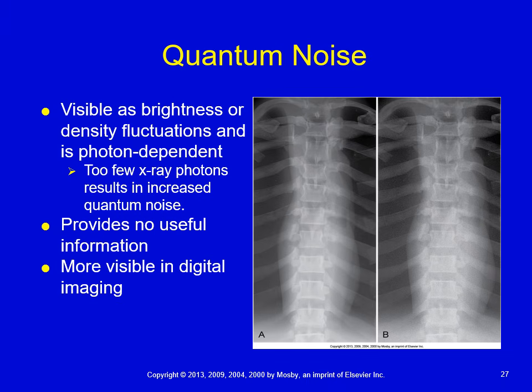Now, noise, if it is present, doesn't give you any useful information. It only will interfere with being able to see the anatomy clearly. And of course, if we were to send this across to the radiologist, it would interfere with the diagnosis for the patient. It would actually delay it because they would probably call back and say, who sent this? Why did they send it? You probably get in trouble, and the patient needs to be called back in for a repeat.